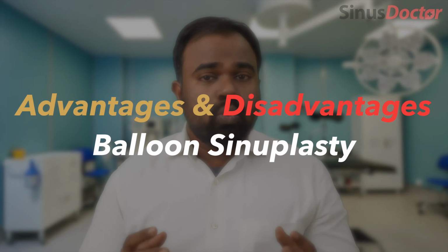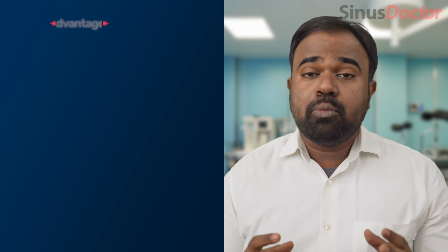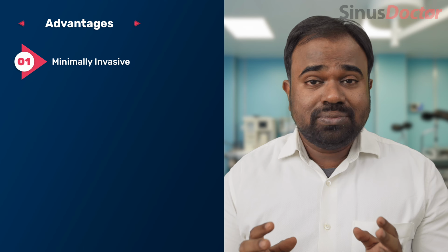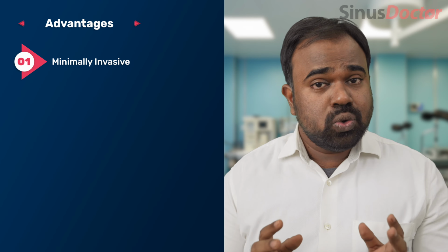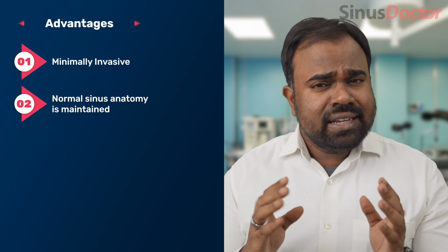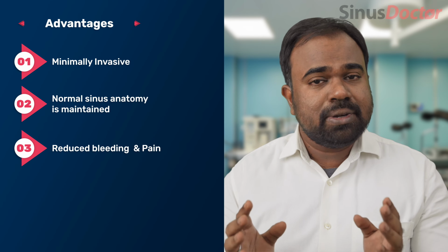So what are the advantages and disadvantages of balloon sinuplasty? Let us first talk about the advantages. Balloon sinuplasty is minimally invasive. There is no cutting involved. There is no need for removal of any bone or soft tissue. Also, the normal drainage mechanism of the sinuses is maintained in balloon sinuplasty. There is reduced bleeding and post-operative pain experienced by the patient.